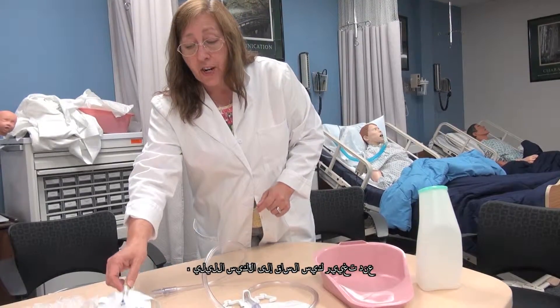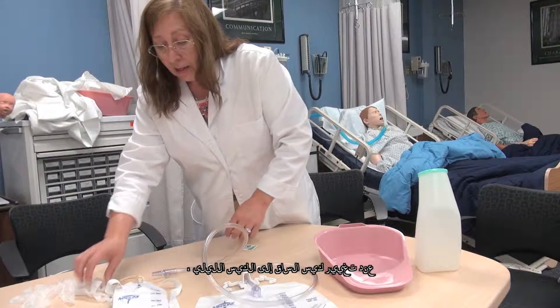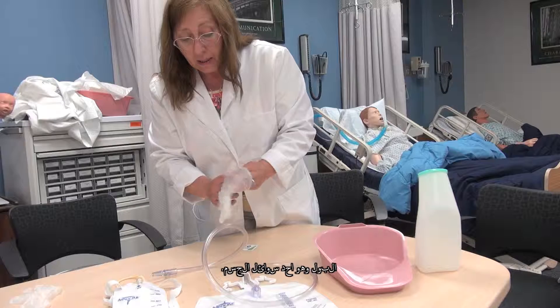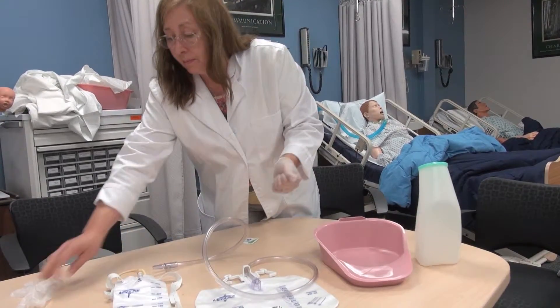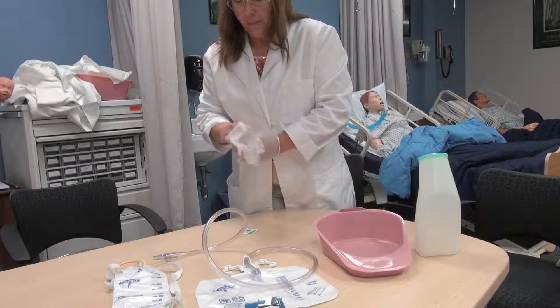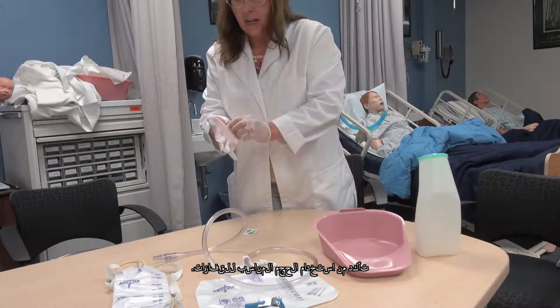When changing from a leg bag to an overnight bag, you need to have gloves on because you're going to come into contact with urine, which is a body fluid. Make sure you find the right size gloves.